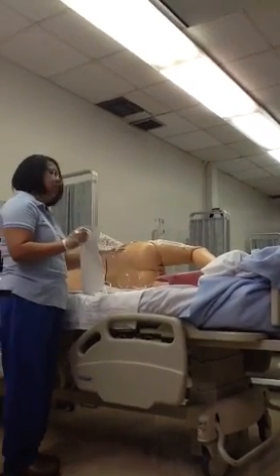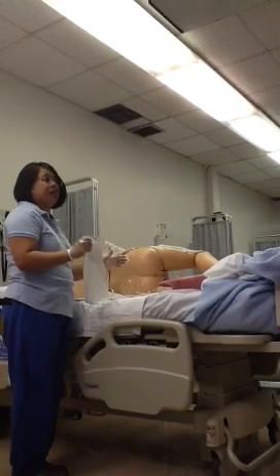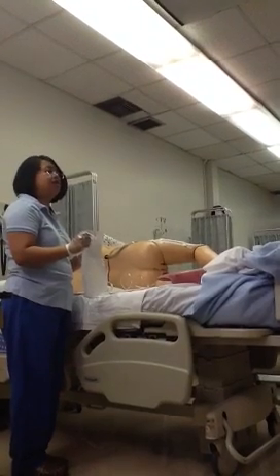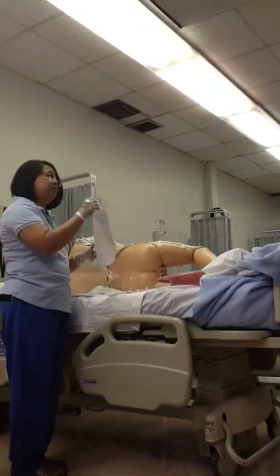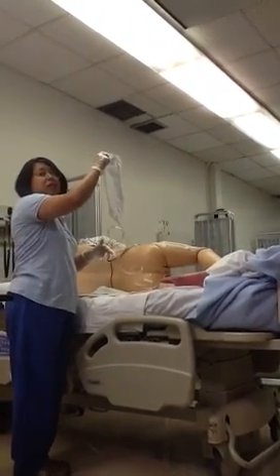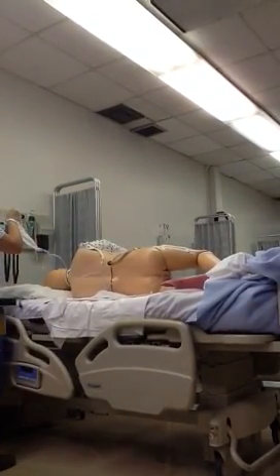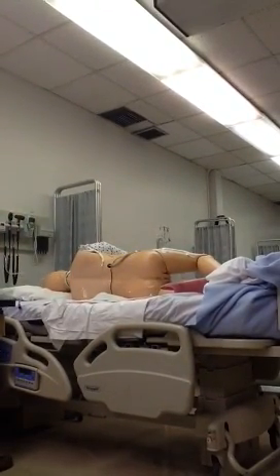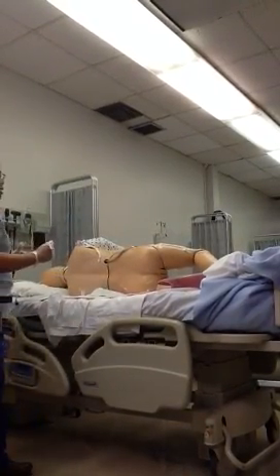Now let's say we're at hip level, and about, I'd say 30 seconds go by. He's actually tolerating it very well. Then go ahead, you could be here all day, especially with 500 cc's. So go ahead and lift up anywhere from 12 to 18 inches, or a foot to a foot and a half. So what are we doing? Infusing it faster. We're increasing the rate of flow, right? And then what we could do is, if you have an IV pole that's at that exact same height, you can actually leave it there, because it's still slow enough. It's just a little bit faster, right? And let that all flow in.